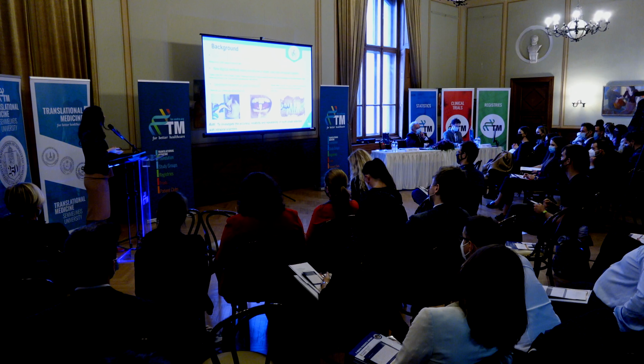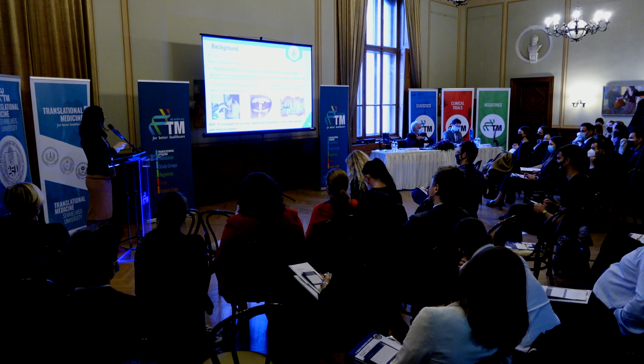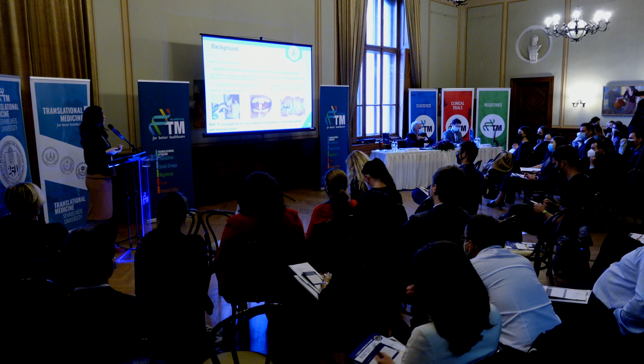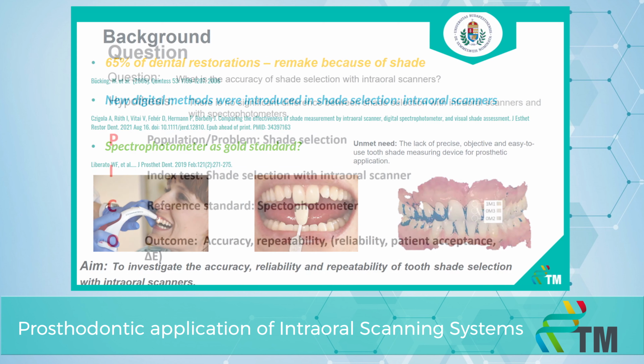That is why new digital methods were introduced in the market, and the first one was the spectrophotometers, and they are usually used as the gold standard in dentistry. But when the intraoral scanners arrived, they showed that they can also make this shade determination as an objective method, and that's why it is very important to investigate the accuracy, the reliability, and the repeatability of the shade selection tool with the intraoral scanners.